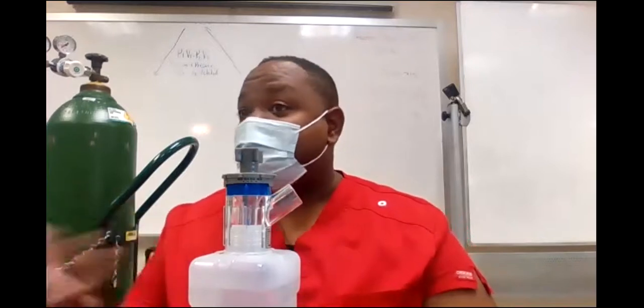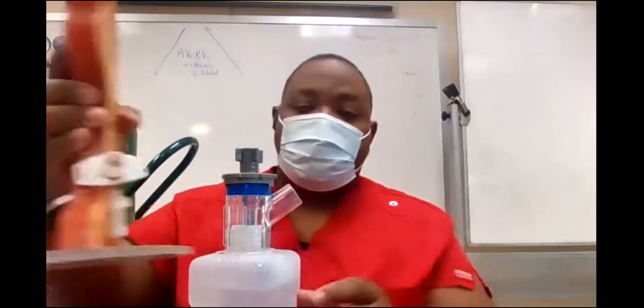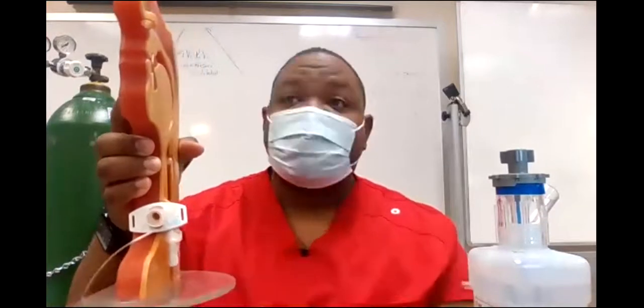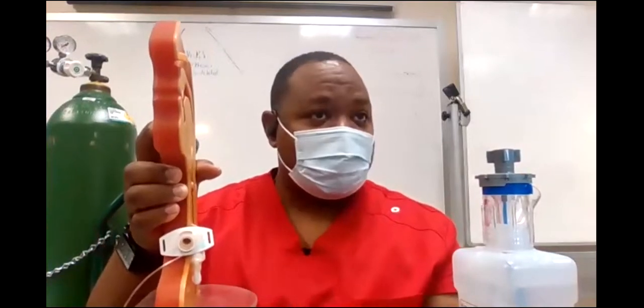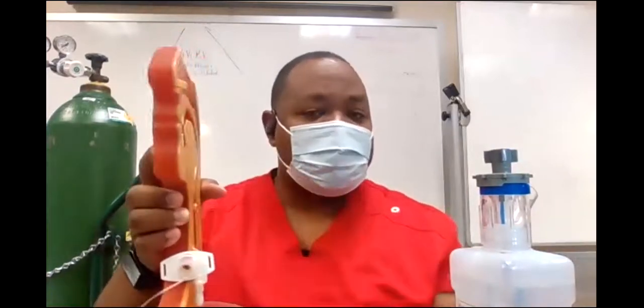Remember we said if you bypass the nose, that gas has to be heated and moisturized because the nose does that job, right? The upper airway will moisten and heat the air. And if you bypass that nose, like on this gentleman here, he no longer uses his nose, he uses his trach. So everything going in here is pure dry, and you're going to dry his lungs out unless we put some moisture on it. We're going to put some moisture on it to keep him from drying out. So we're giving him the oxygen, the flow, and the moisture because his nose has been bypassed.